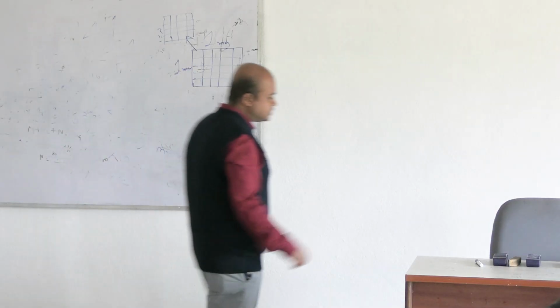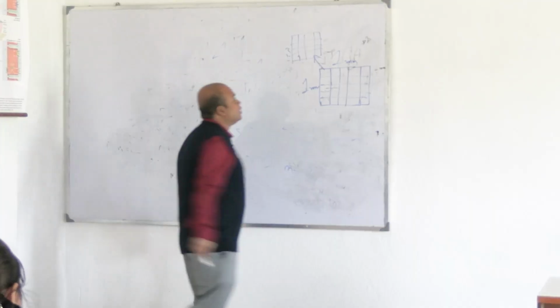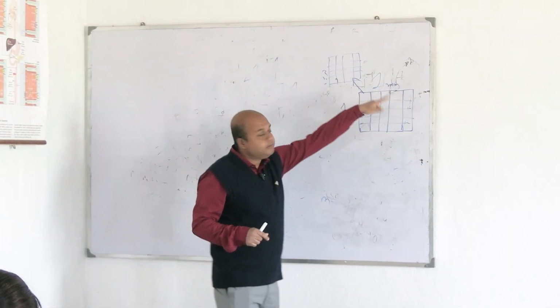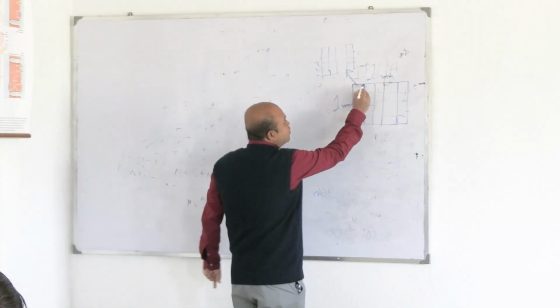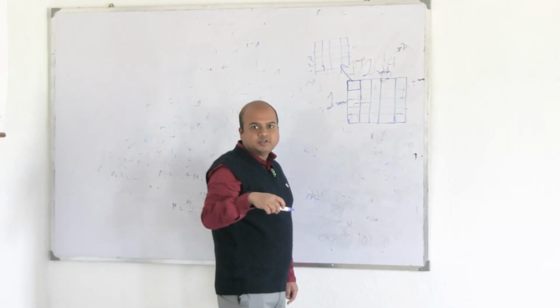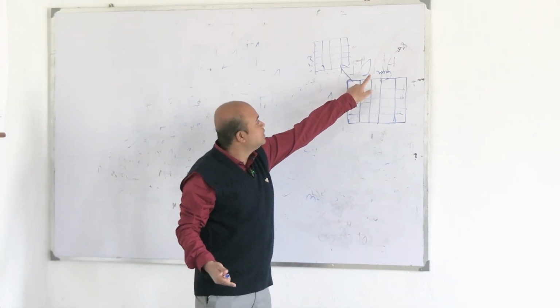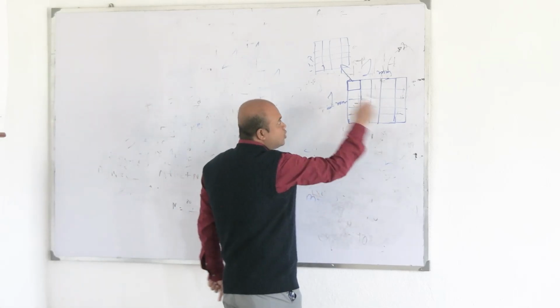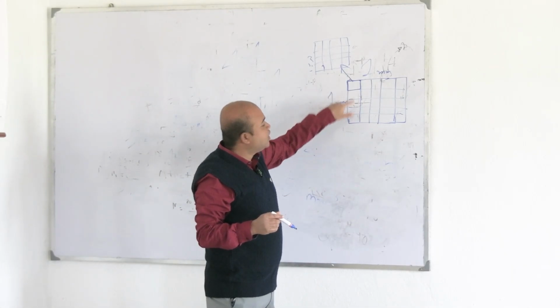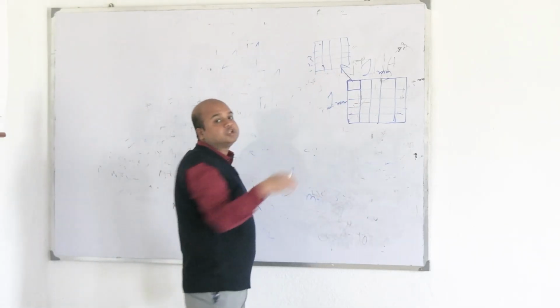What is the case in RBCs? What will the calculation be like? So this is 1 millimeter into 1 millimeter square. In case of RBCs, it is actually this. WBC has two types of divisions: large WBC square and small WBC square. In case of RBCs, it is the large one. These are medium ones, 25, and each of these is divided by those triple lines into these. So these are the smallest ones, or small ones.